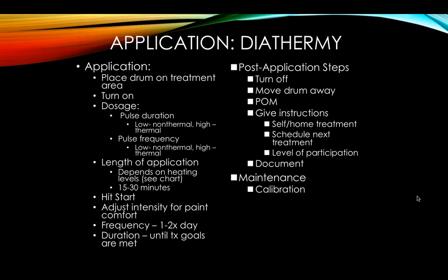You hit start, you adjust your intensity for the patient comfort. Your frequency is 1 to 2 times a day, your duration until your treatment goals are met. So you could do this, as long as you're seeing goals being met, you would continue to use it. As soon as you kind of plateau, you would think about using a different modality or moving them on to something else. But again, exercise is number one, modality second, so how is this facilitating us getting them to the point that they can actually use that body part and use it effectively.